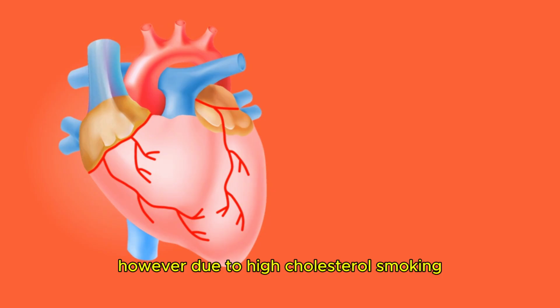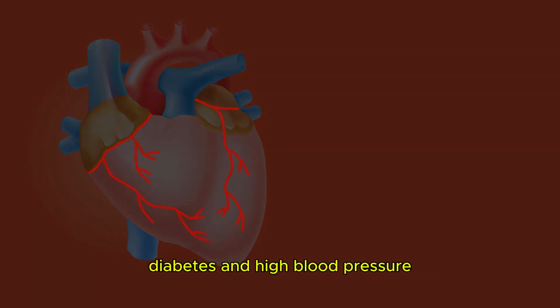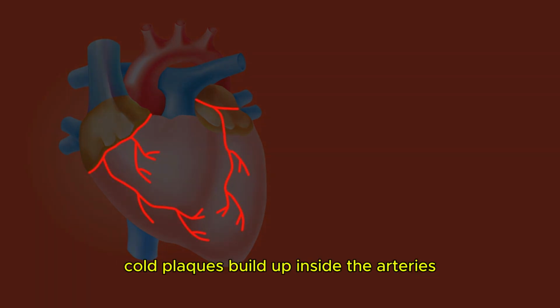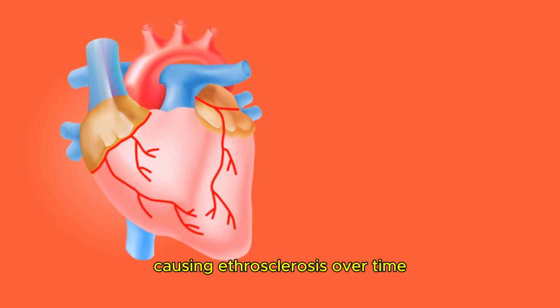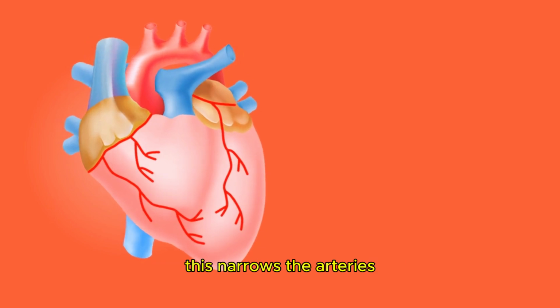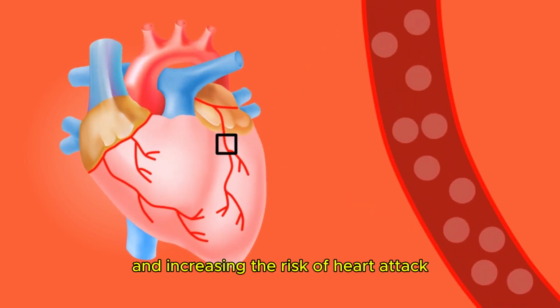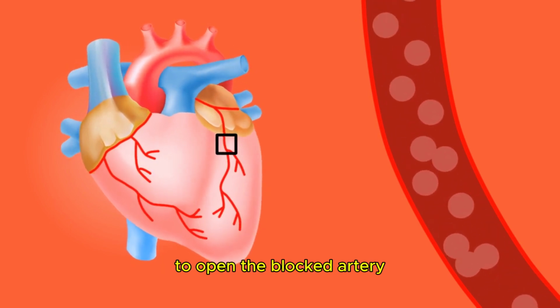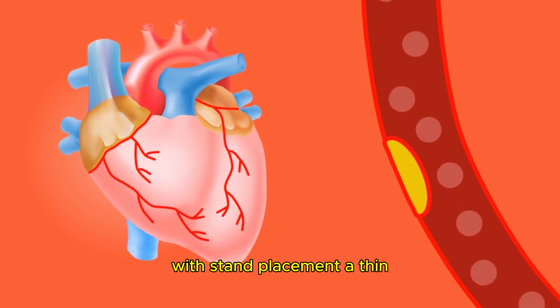However, due to high cholesterol, smoking, diabetes, and high blood pressure, fatty deposits called plaques build up inside the arteries, causing atherosclerosis. Over time, this narrows the arteries, reducing blood flow and increasing the risk of heart attack. To open the blocked artery, doctors use a procedure called angioplasty with stent placement.